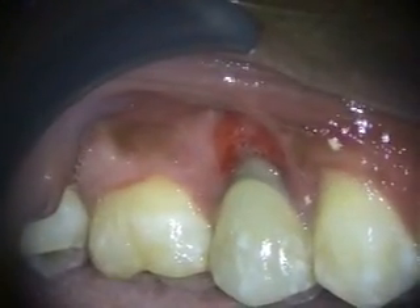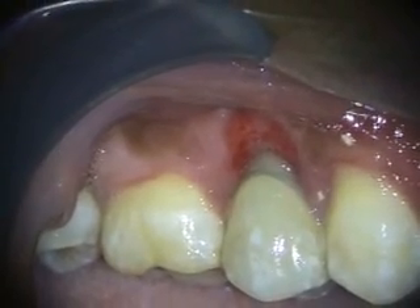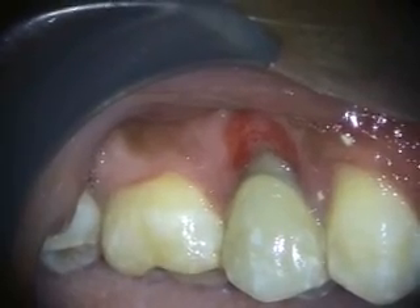This is one-month healing, and we've been packing this repeatedly. I think now we don't need to pack it. We're going to have them dab chlorhexidine on there, and I'll take a look at it in a couple weeks.